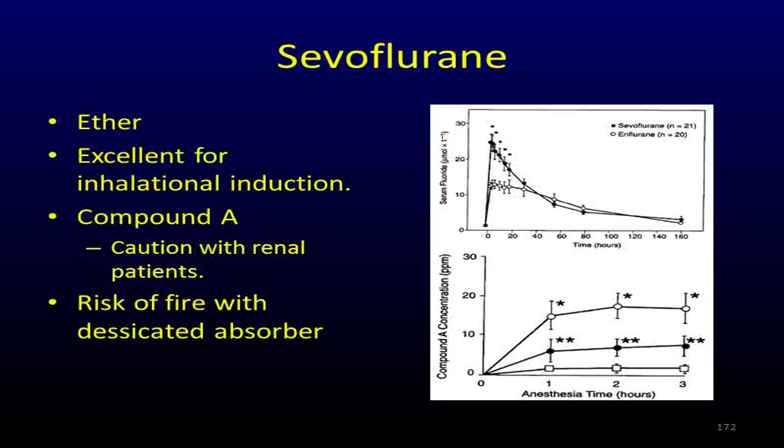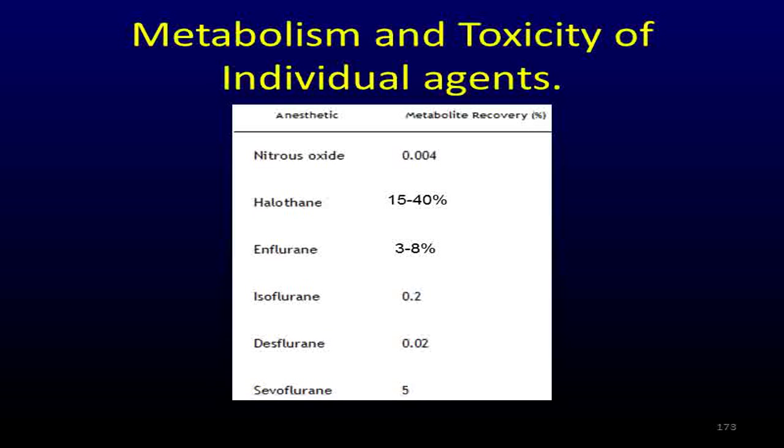But say you have a semi-closed system where the patient's rebreathing some of their own gas, like in low flows, for example. Well, the sevoflurane could interact with that mesh, that CO2 scrubber, that soda lime, and create this compound. And then when you breathe it in over a significant amount of time, it could hurt your kidneys. It could. And there's more to say on that.